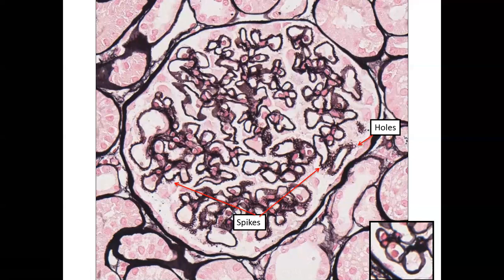Okay, and then I'm trying to see, this one right here, if everybody can see these tiny little discrete holes, what this is almost a glancing blow of a capillary loop. And so in my descriptions, when I write these kinds of cases up, I talk about en-face sections of capillary walls. So you basically have a glancing blow of this 3D structure, and you can see these holes are where the deposits are, and this is all the GBM matrix around it.